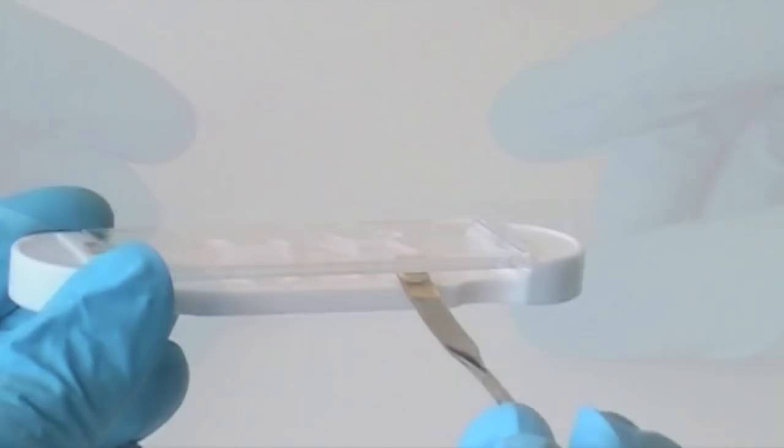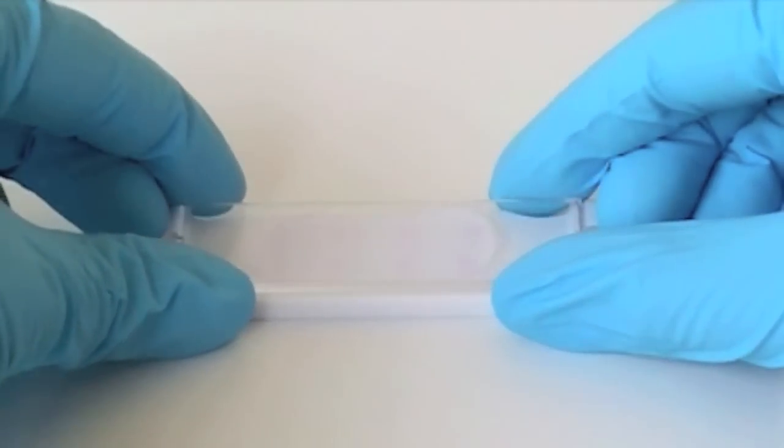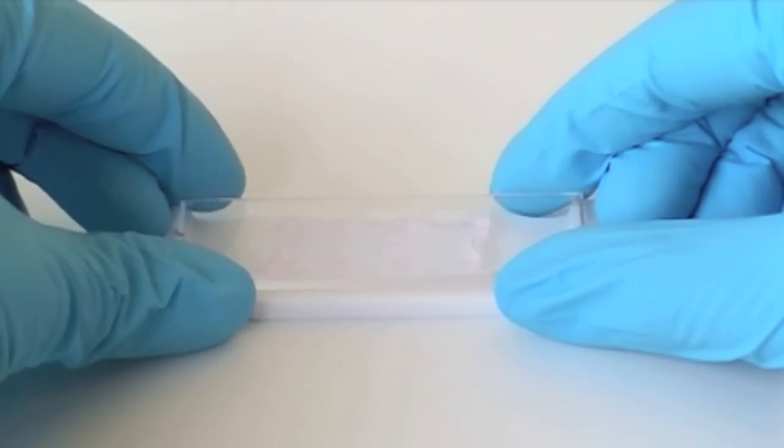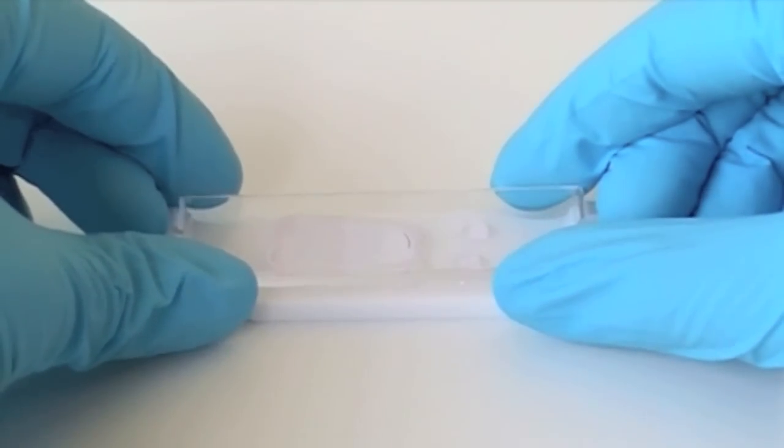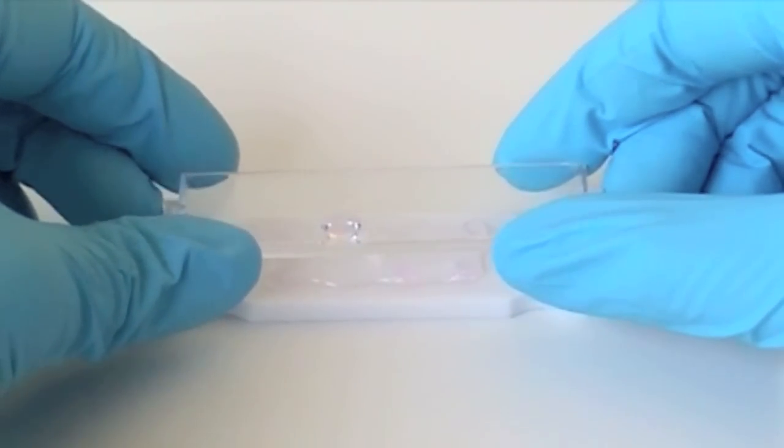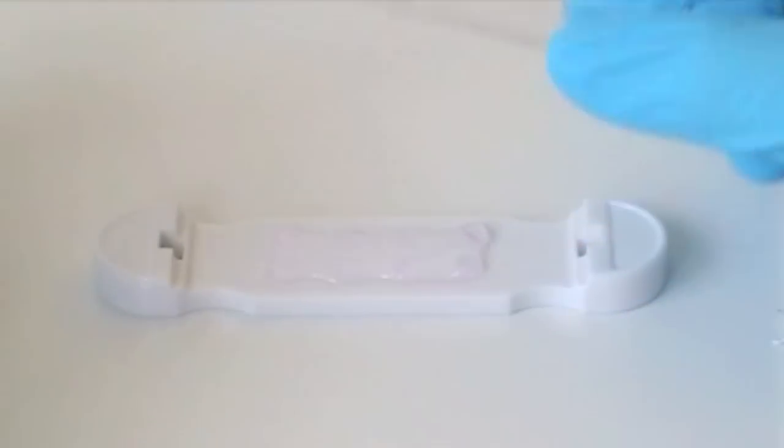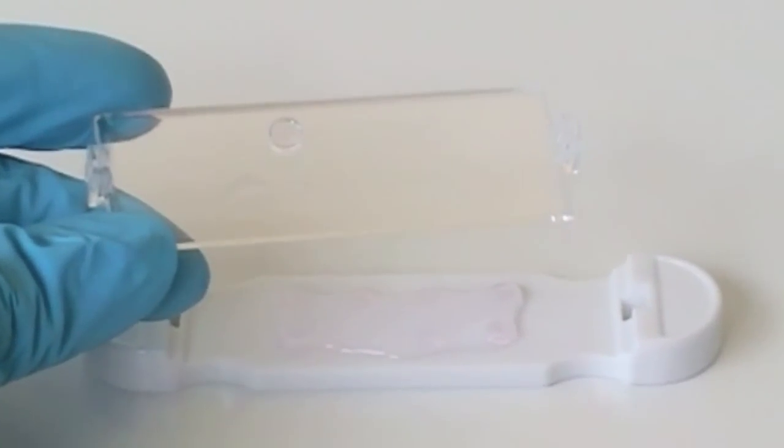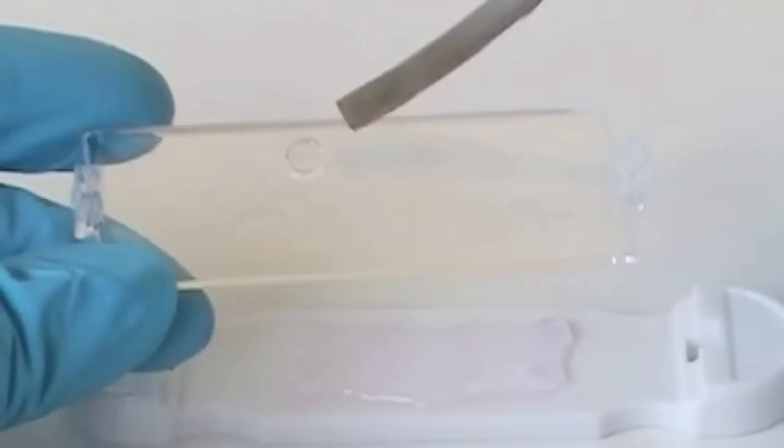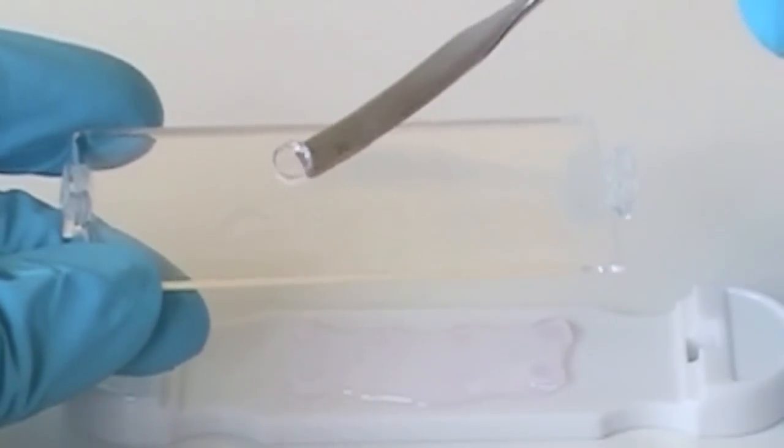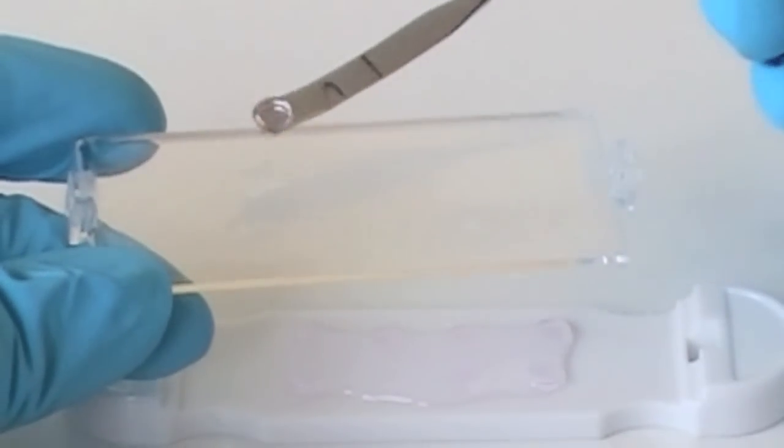Now, the caster can be opened slowly and the disc can be released. Sometimes, it happens that a disc adheres to the top part of the caster. This is not a problem. It can be transferred as every other disc in a well plate with the help of a spatula.